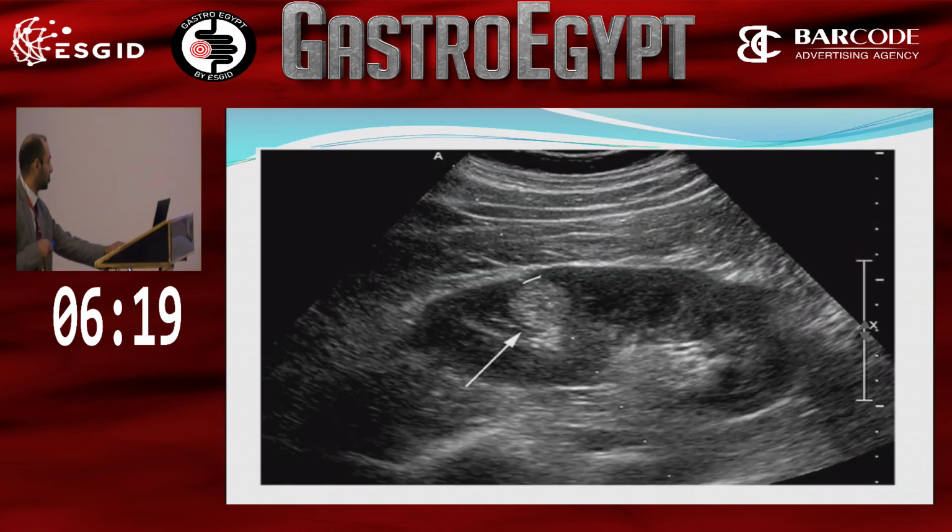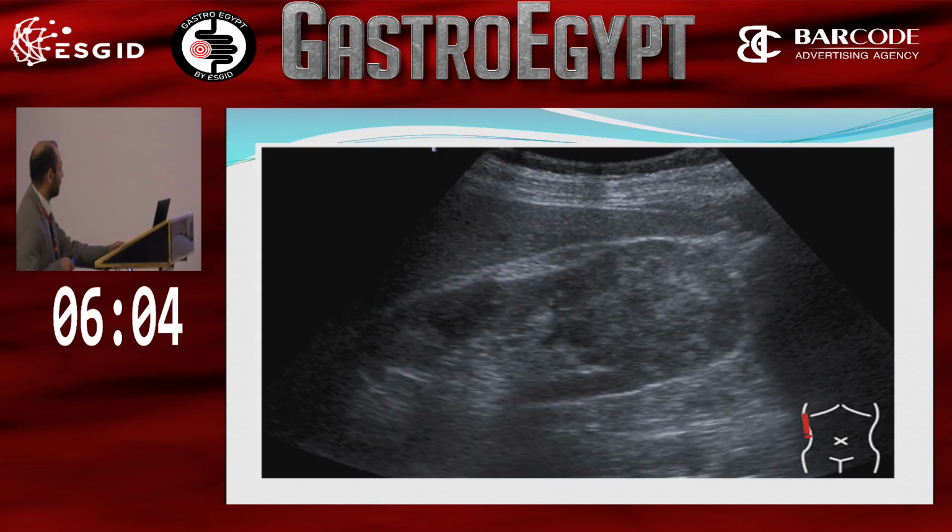Most echogenic lesions in ultrasound are probably benign, in the liver, the spleen, or in the kidney. I should also do a next step to exclude. I have here a lower polar soft tissue lesion. It's probably neoplastic.